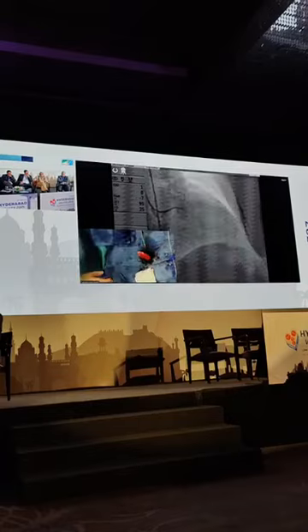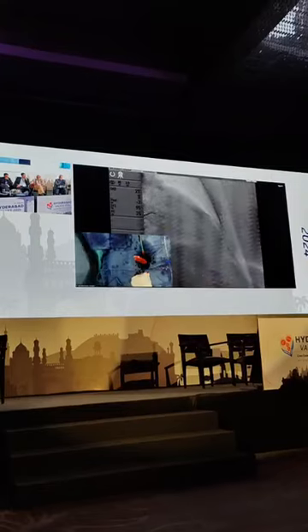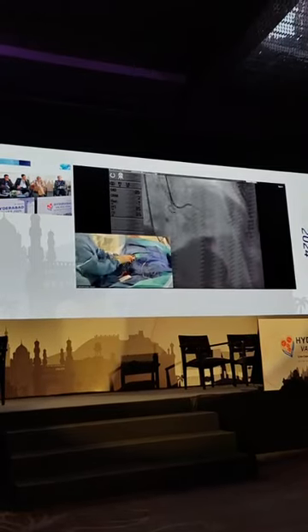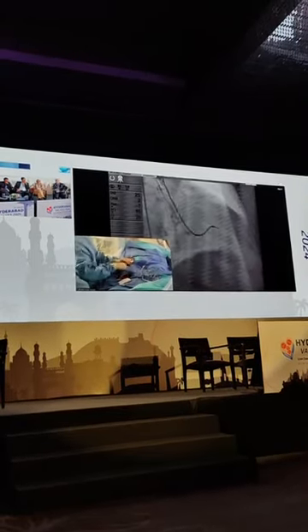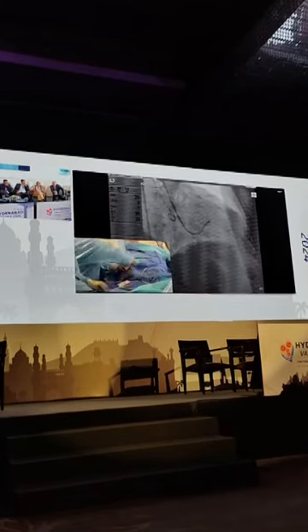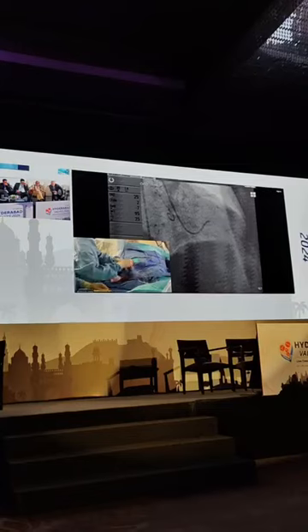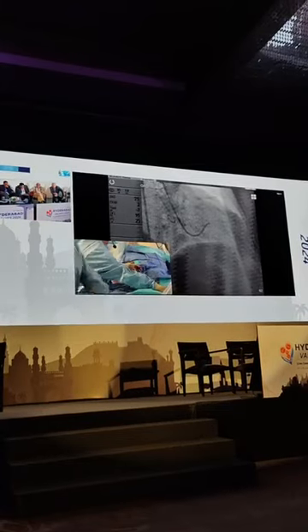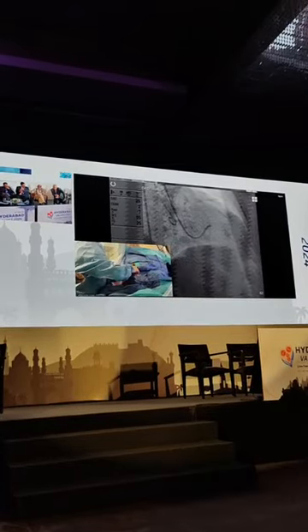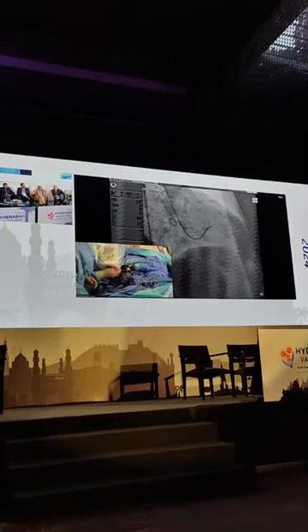So I have to move to LAO because we don't want to create any damage to the left ventricle. So you move to LAO. We take a gradient, but we know it from echo. It's just for us and to show you. Okay, we take a gradient. The stenosis is very tight.